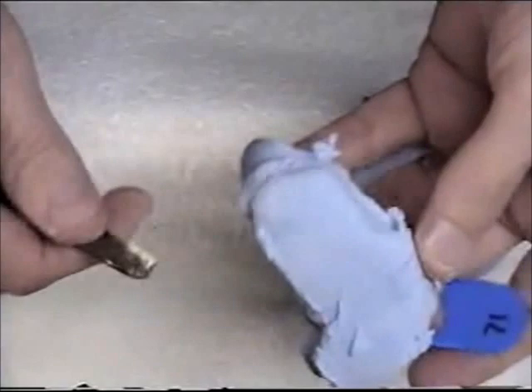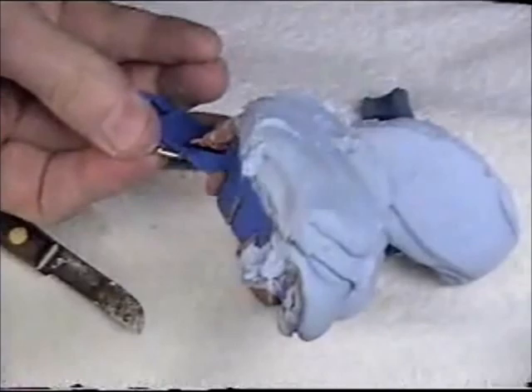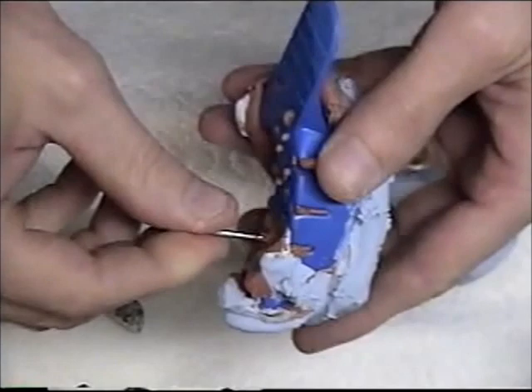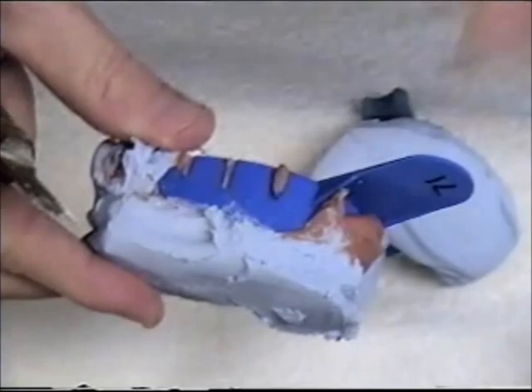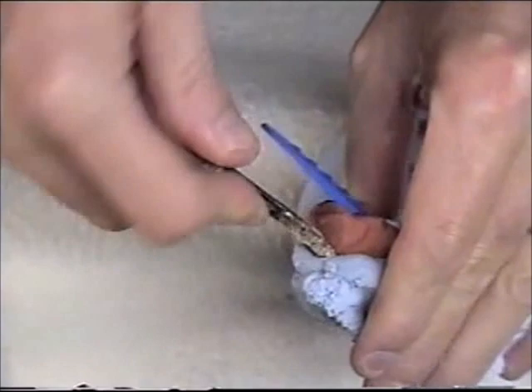My die stone is now hard, and I can remove it from the impression tray. So the first thing that I do is get my screwdriver and unscrew the guide pin and set it free. This will release it from the analog. And at this point, I just find a place to start opening it. It's like a regular model.